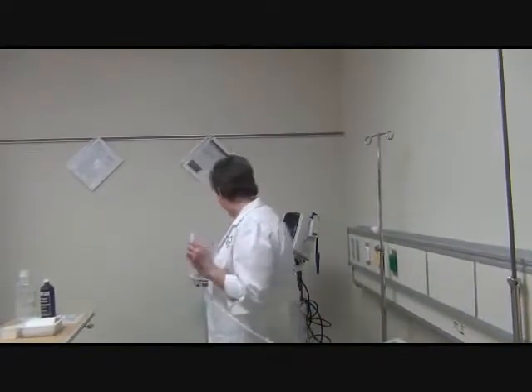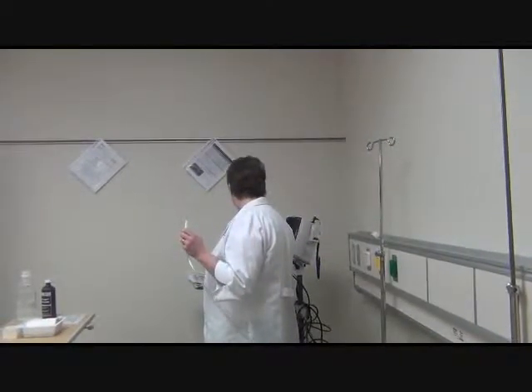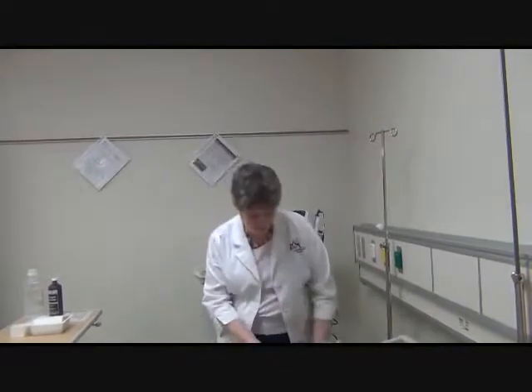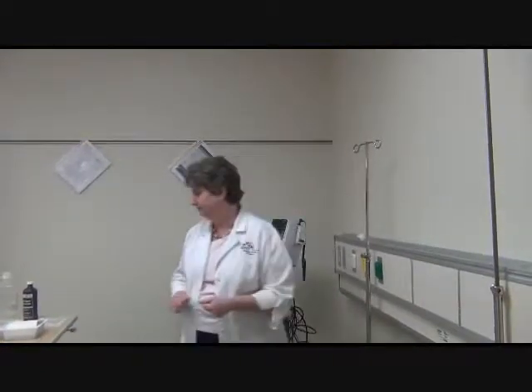Usually they will have your suction hooked up. It will be capped to maintain a clean system, and or a Yankauer suction if your patient has a lot of oral secretions. We don't have the cap, which often you're not going to have. So what you can do is cover it with some type of cap to close off the system, or you'll have like the Yankauer cover or something like that. So I'm just going to put that, and they'll have that tucked up at the end of the bed, which is considered the clean end of the bed.